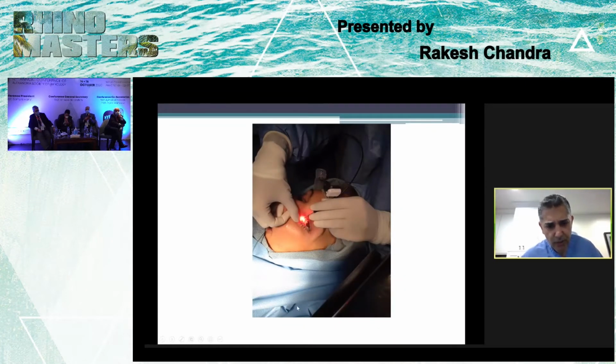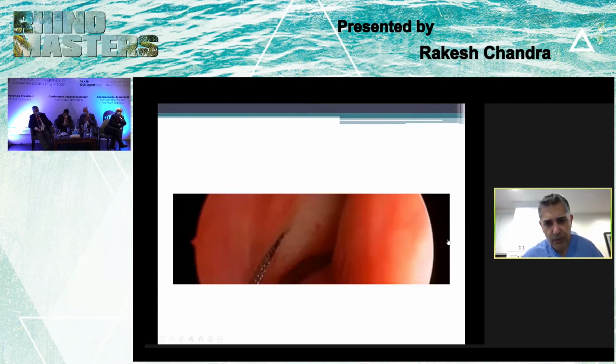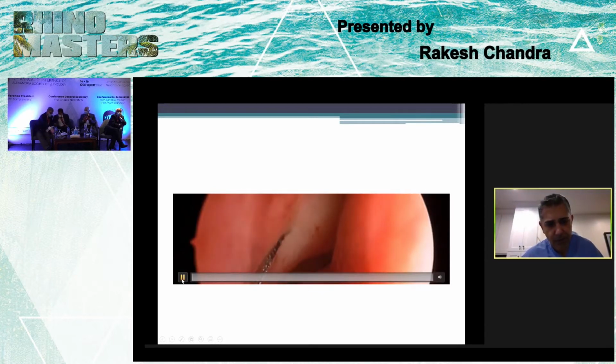The process of cannulating that duct is done by the oculoplastic surgeon, and one useful adjunct that they sometimes use is this light pipe, which is a transillumination method for us to see where that lacrimal sac sits on the side wall of the nose. So in this case, I'll have a little video to show you.